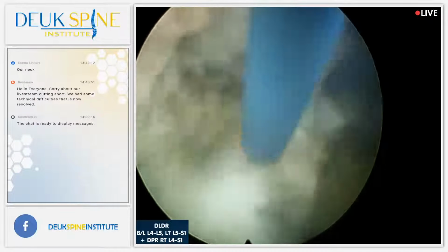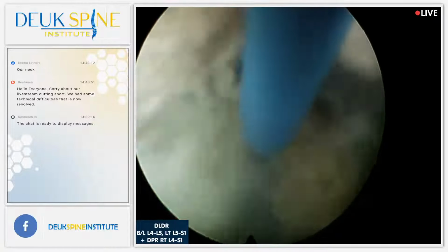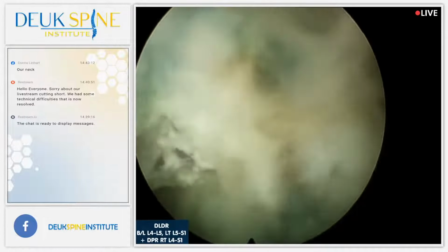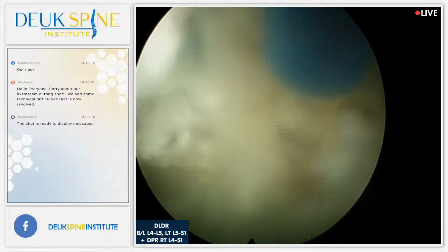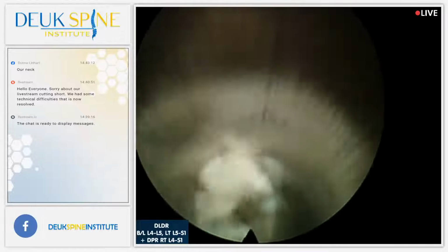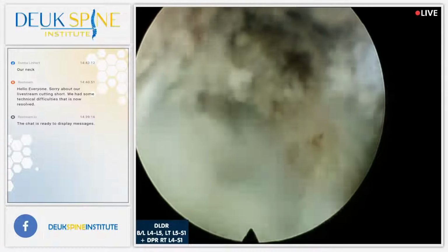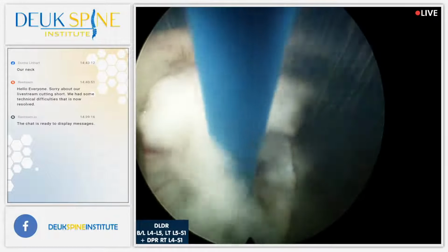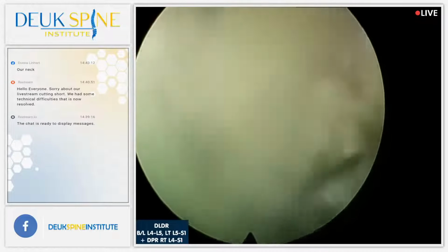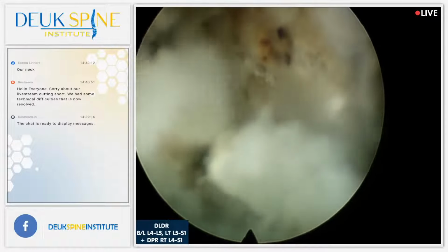Welcome back. We're just getting ready to move from the L5-S1 disc over to the L4-L5. Everything okay? Mm-hmm. All right, let's go ahead and I think we're done here. We're done with the 5-1.